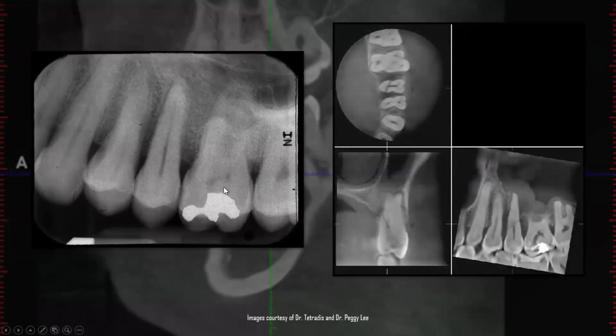And it's kind of crazy what a different story it tells in this case. This is one where they actually do see the fracture line. Do you see that fracture line in the tooth? There's enough separation between those tooth pieces that you see the fracture line. But even if you didn't, you look at the bone around the tooth, and the maxillary sinus border here is completely discontinuous.